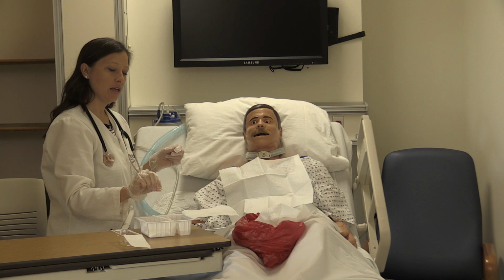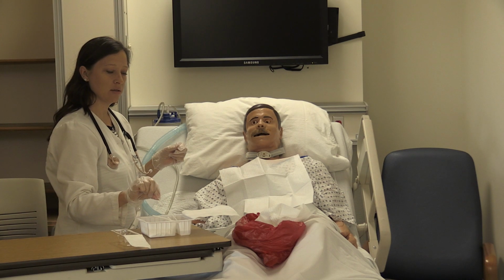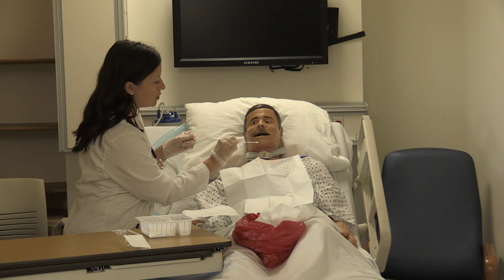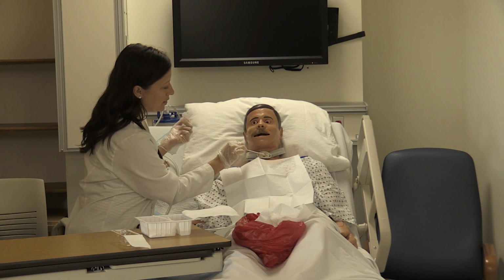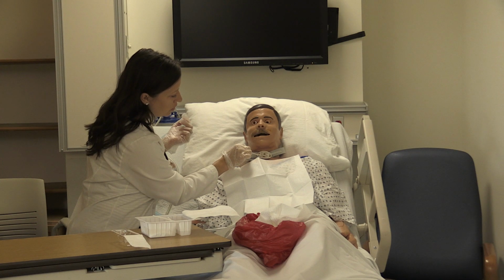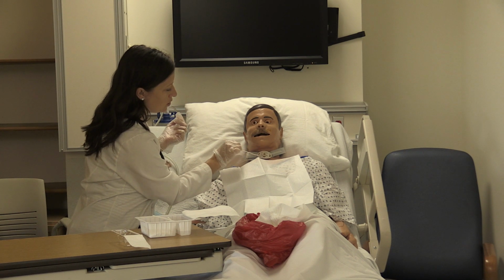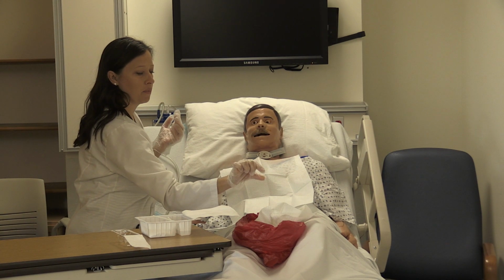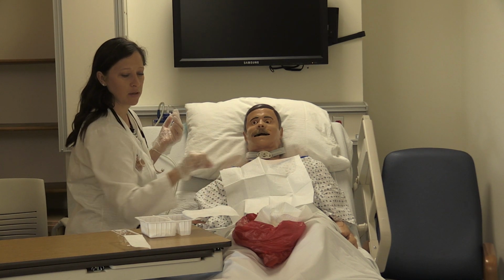Dip it in the water, making sure not to cross over your sterile dressing or anything. So dip it in the water, and then what you want to do is you want to go distal to proximal when you clean. So for example, I want to clean down here. I'm going to start on this side, and I'm going to come across this way. So distal to proximal, and then you don't go back through it. And then you throw this away, just like that. You don't put it in the bag, you just drop it in the bag.